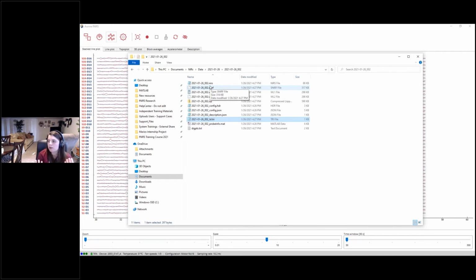But just to wrap up, the important takeaways here are that we use PsychoPy to establish an LSL connection, and we sent triggers via LSL. They were received in Aurora. We saw them visually happening, and that was a nice sanity check. And then we checked the data, and we saw that they were in fact there and recorded relative to the starting and stopping of the fNIRS data. So that is all that I have to share as it comes to the presentation.